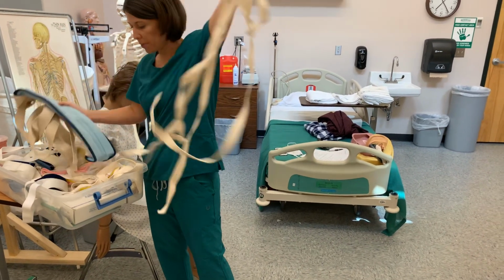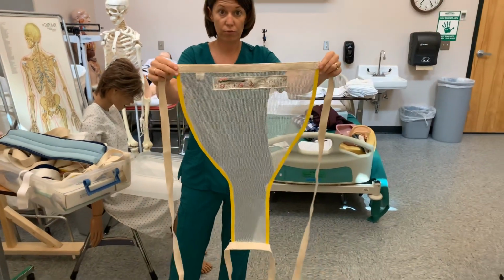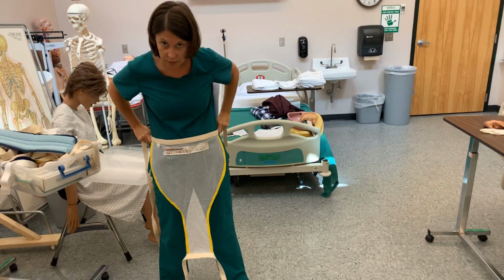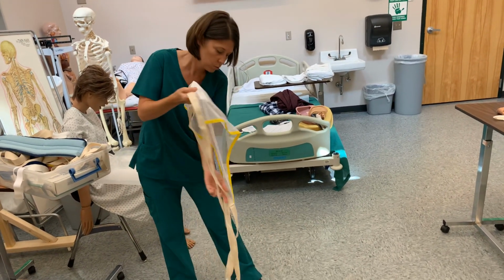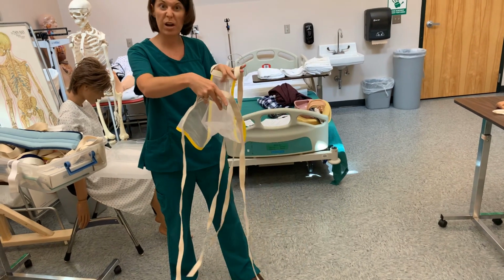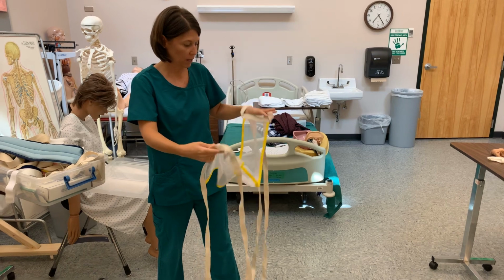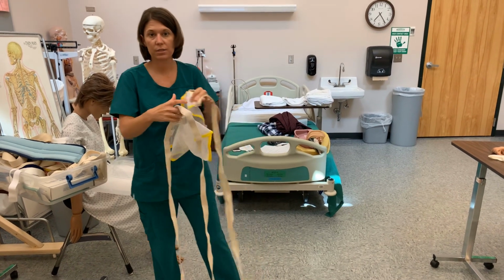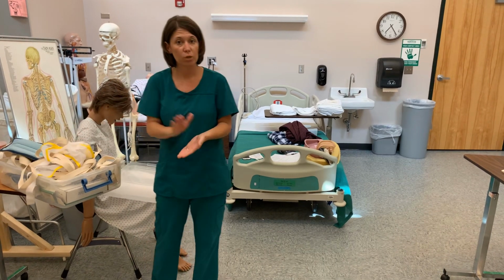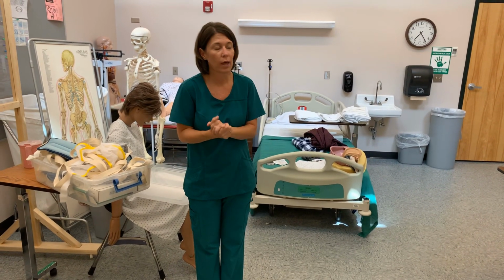This is called a pelvic restraint. You will notice the front, the part that goes here, fits like that. This goes posterior to the back side of my patient. So it actually fits like a pair of thongs, okay? Wide front, skinny in the back, and then you just use your slip knots and tying those as well. You don't see these devices as much anymore, like I said, but we never know, you may come across those.